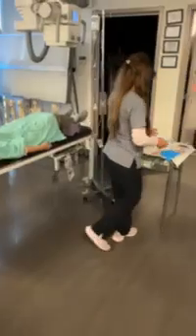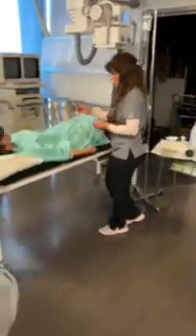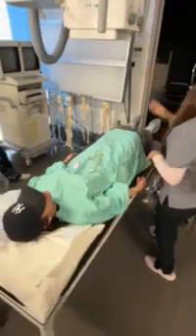Okay, this is a bolus injection because it's all at once. In the meantime, what's going to be happening is we're going to start seeing our first minute. You've got to be right on it. The radiologist might look at the patient: Feel okay, ma'am? Do you feel like vomiting? Nothing is happening? Okay, so he's going to walk away and say, take your images.